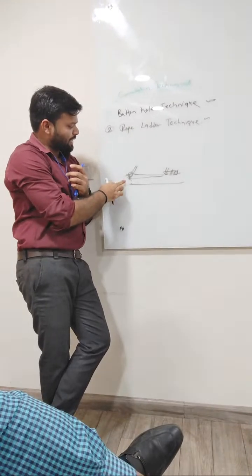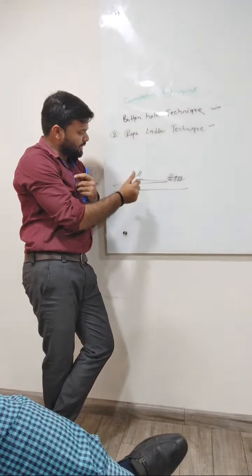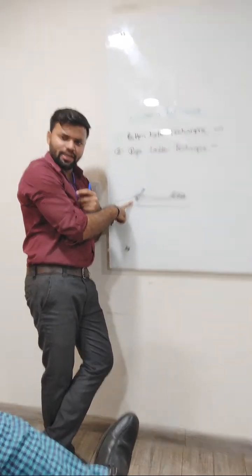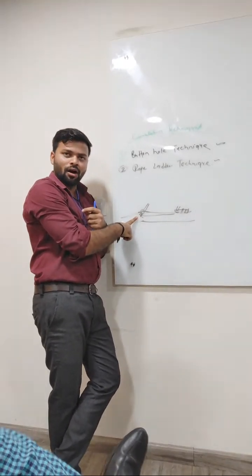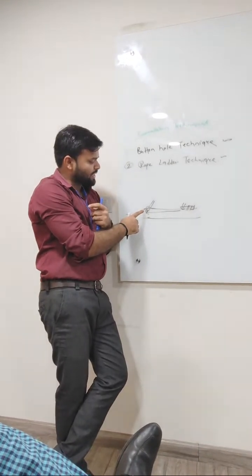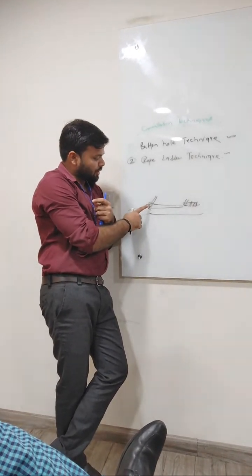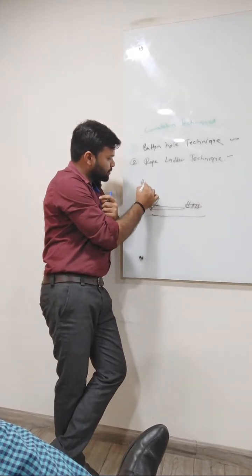There are some advantages and disadvantages of this kind of cannulation technique. Basically, in this technique the patient feels less pain in dialysis, and it is easy to cannulate. A trainee staff or a normal technician can cannulate this kind of fistula easily. But there are also some disadvantages: the patient can have severe complications due to the buttonhole technique, like a chance of aneurysm.